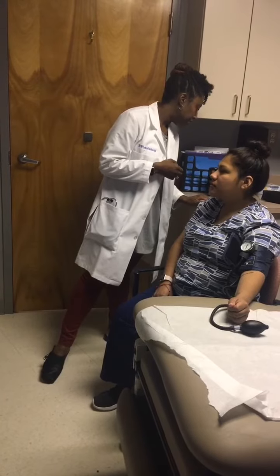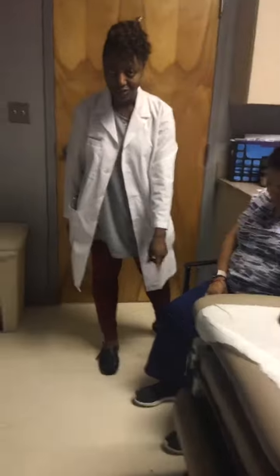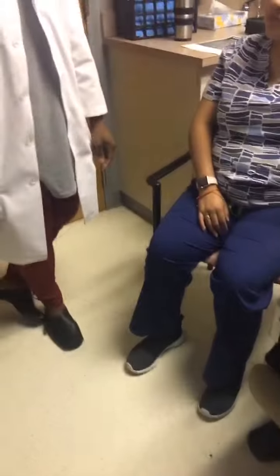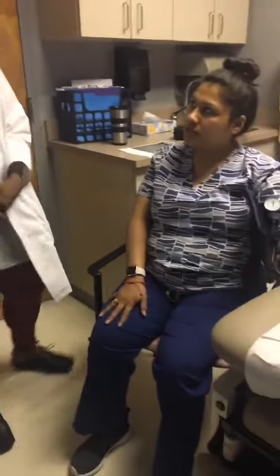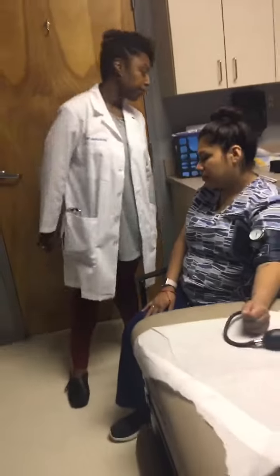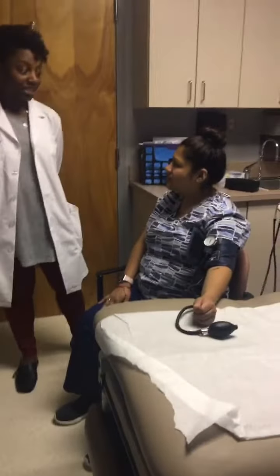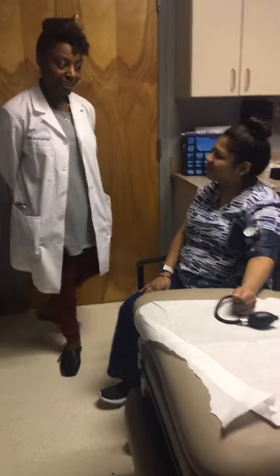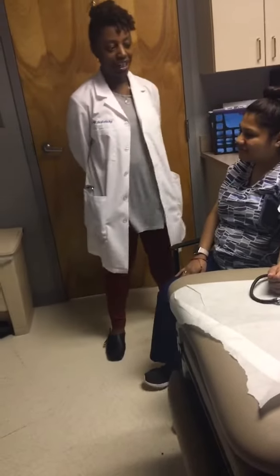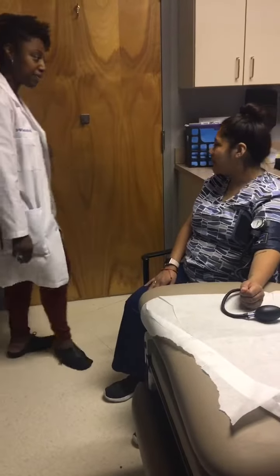Let's make sure we hit everything. As you can tell, her feet are now flat on the floor and they should not be crossed — some people cross their feet at the ankle, some people cross their legs, but you should not have your feet crossed in any way. They should be as flat on the floor as you can get them. I think we are all set. Are you pleased with your blood pressure today, Janet? Yes, ma'am. I am pleased with it as well — let's keep up the good work and we'll check it again in a few weeks. Alright, take care. Bye.